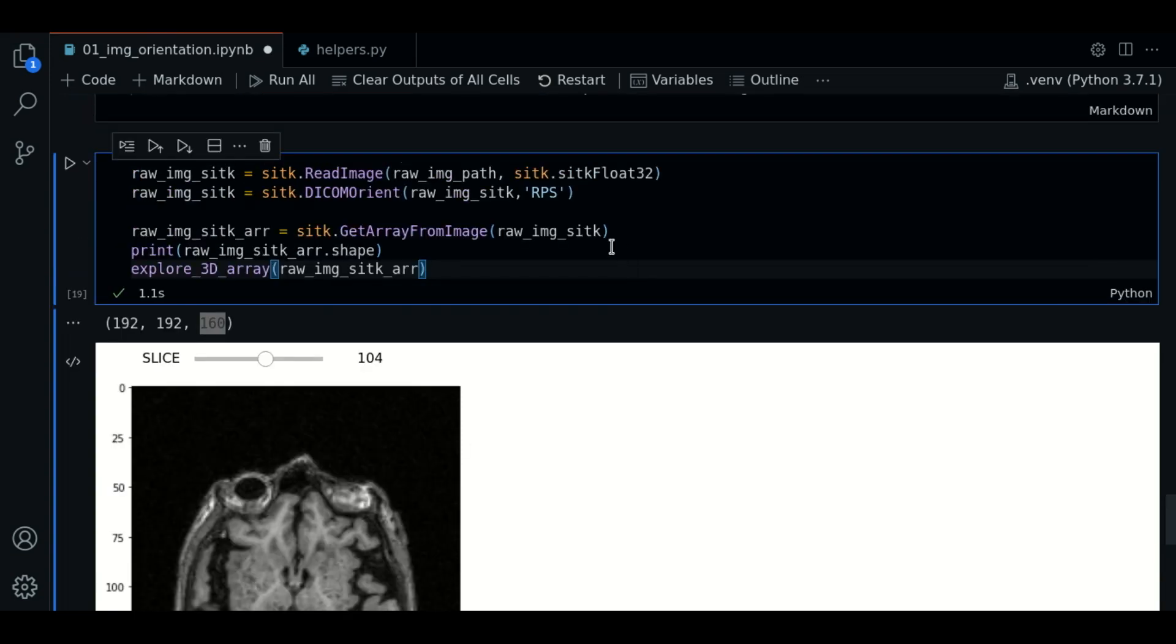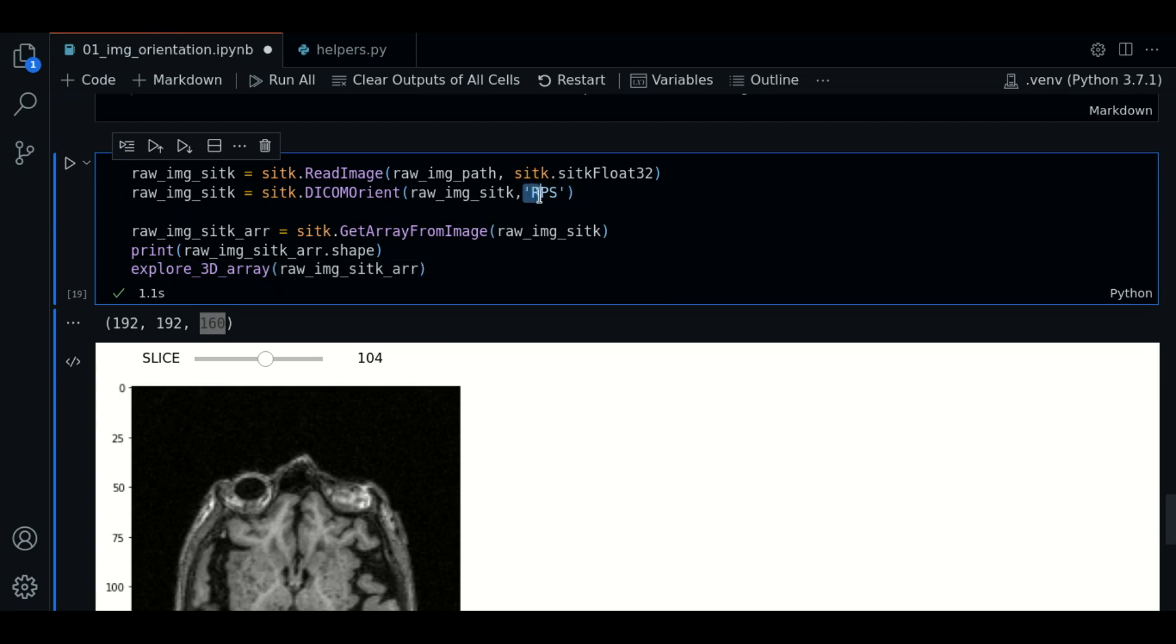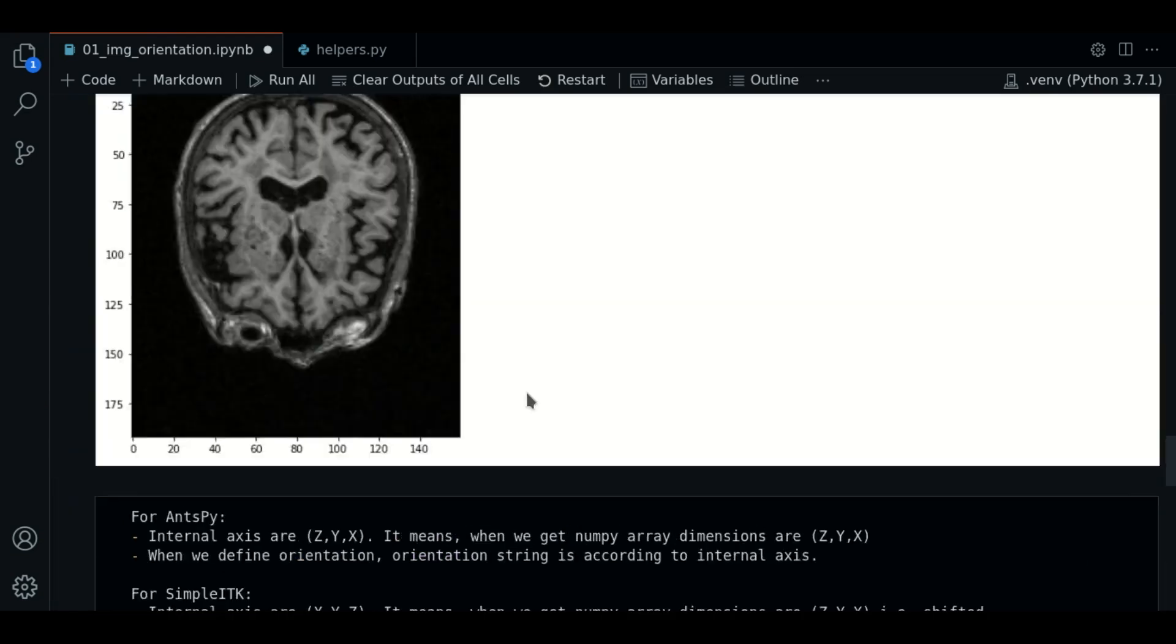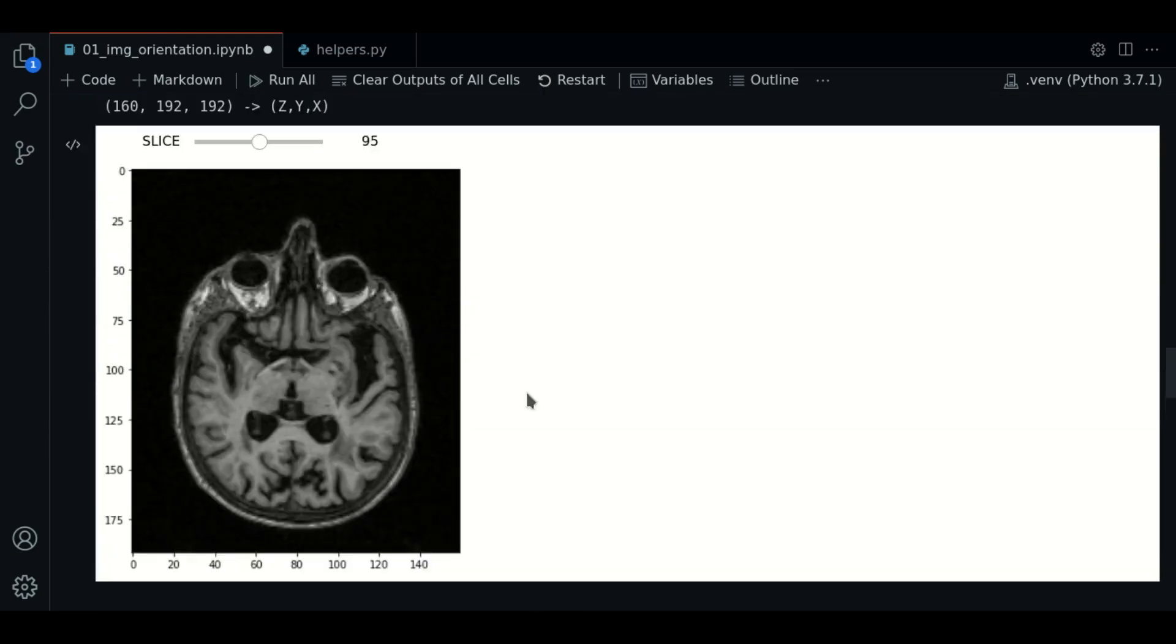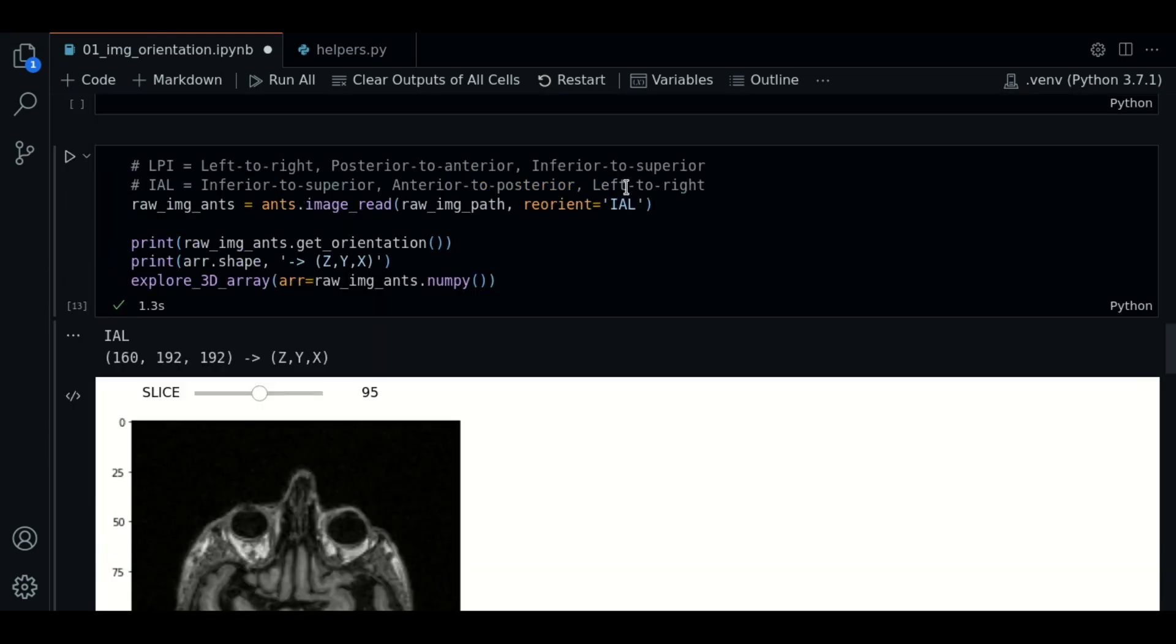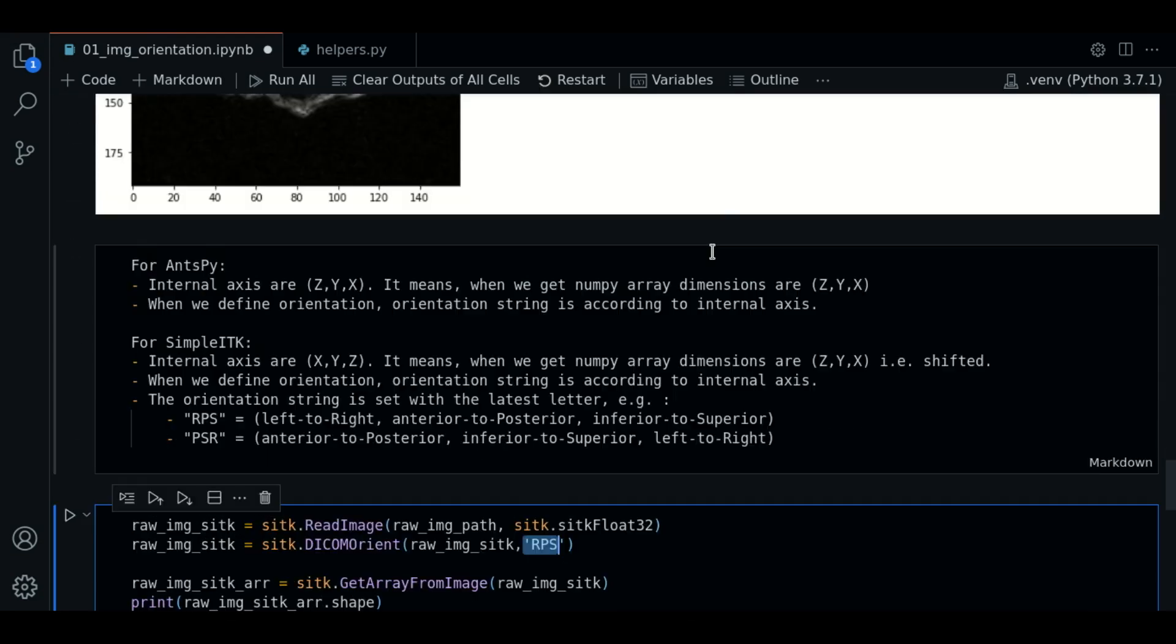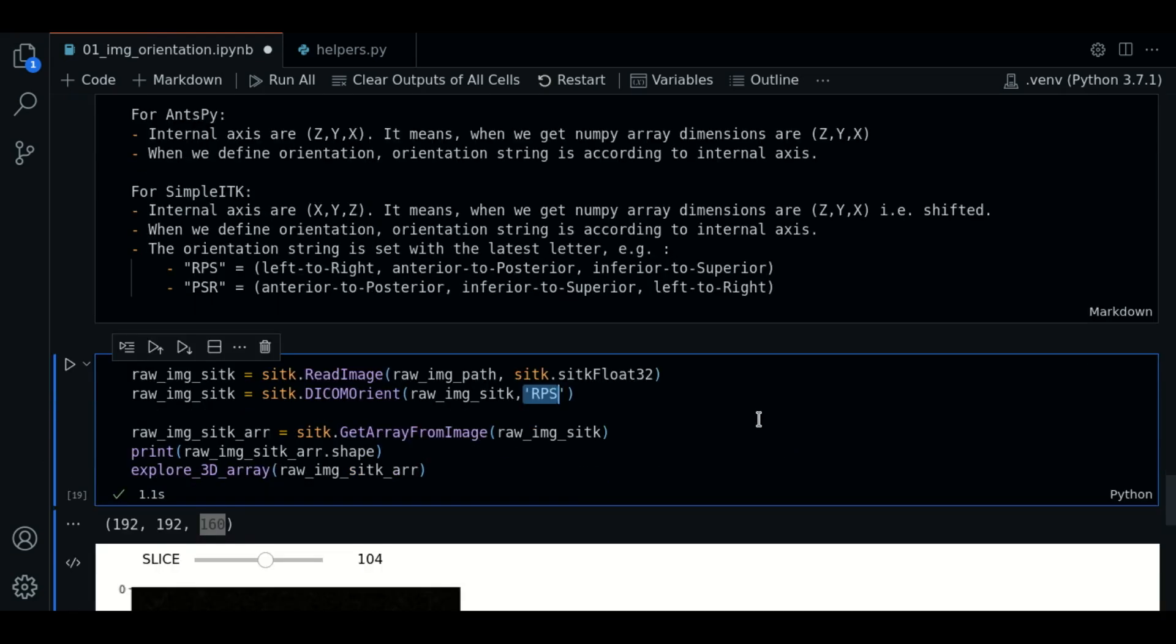So, notice that this RPS string is giving us the same result as the IAL in ANTSPY. And this is due to the difference in the way that both libraries handle the arrays internally. Or we can use each orientation in the string depending on the library that we are using.